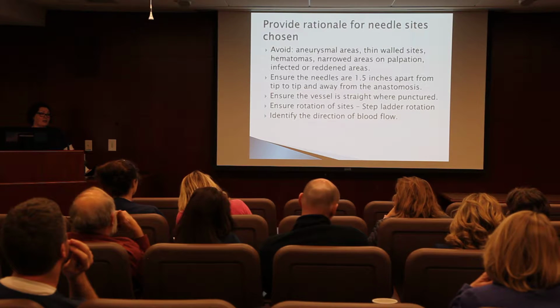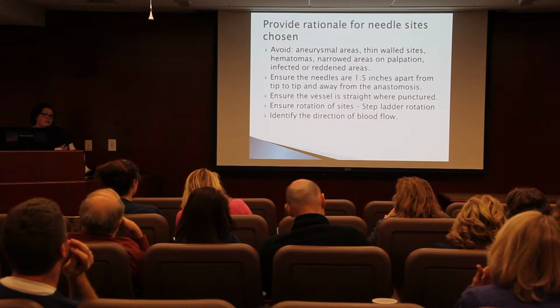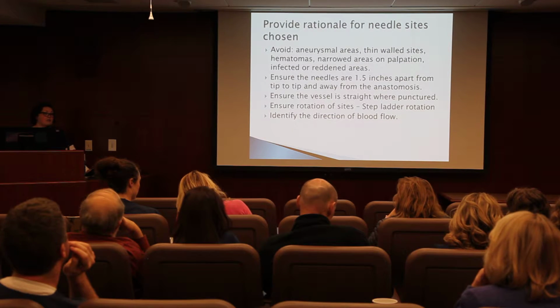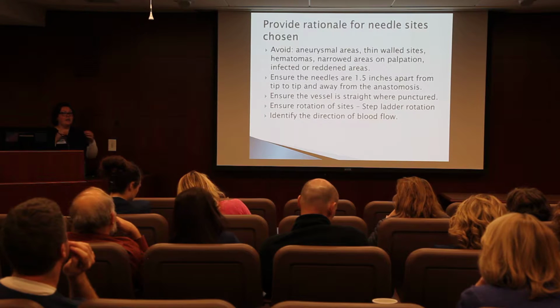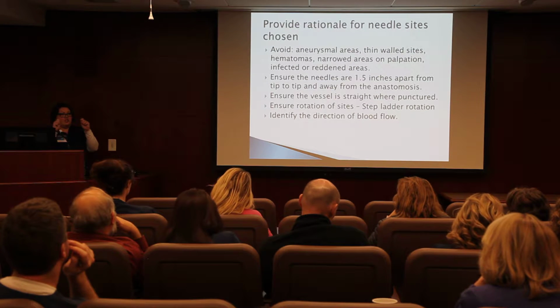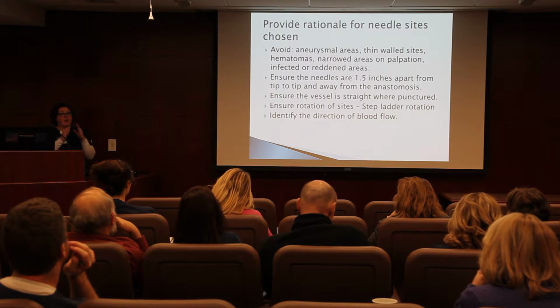Go above it or in between. Thin-walled areas are a huge no-no when assessing where you're going to place the needles. That thin-walled area is what it is because that fistula has been stuck over and over repeatedly in that same area, and it's just like a balloon: if you stretch it and stretch it and stretch it, it gets really, really thin. You stick, and the skin will become shiny.